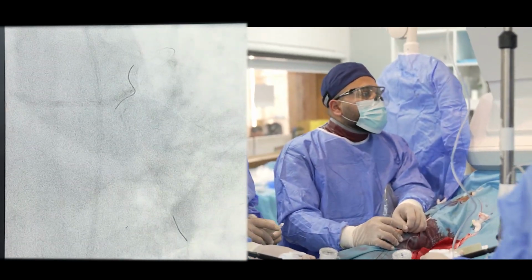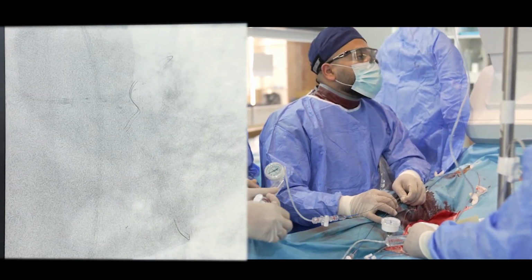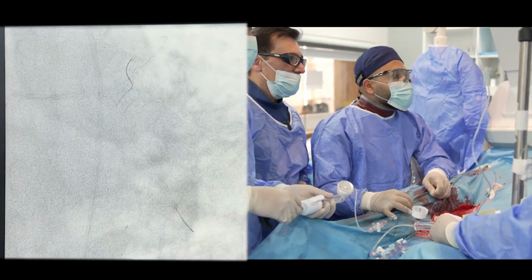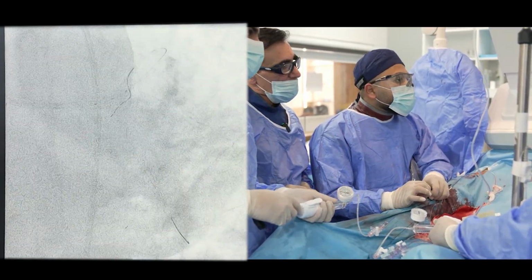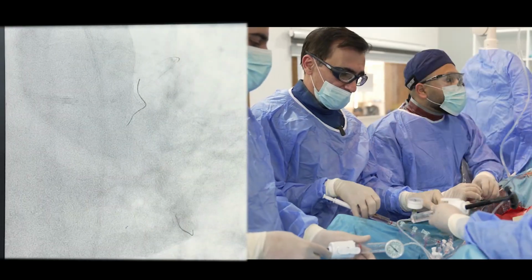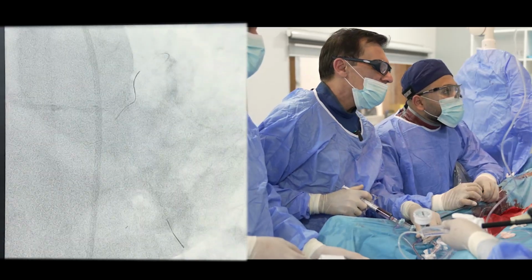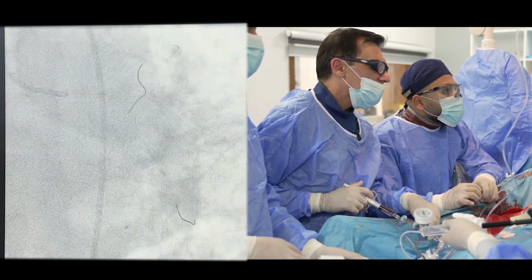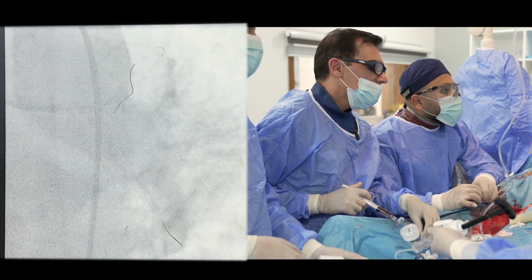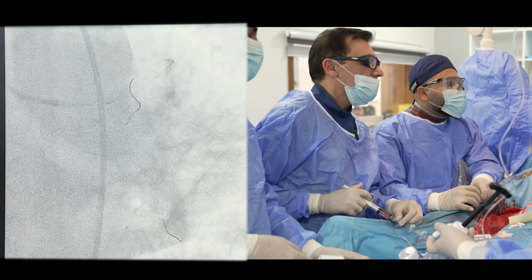Okay, take out the balloon of the circ. And let's go for POT. Only the circ. Yeah. And we have to do POT for the segment before the bifurcation. We have to give some dye to make sure we are not at the carina. Push the balloon. Push. Yeah. Pull it a little bit. Pull. Okay. Let's do some angio.